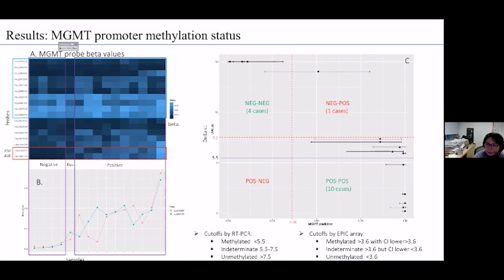Methylation profiling can also vary across sample regions within a single tumor, as shown here with a patchy pattern of beta values. Variable detection can also occur across platforms, for example methylation-specific PCR versus methylation array, which could be different methods. Overlapping but different locations of CpGs are interrogated by different assays, which is another factor. All of these affect the determination of methylation versus unmethylation of MGMT promoters.